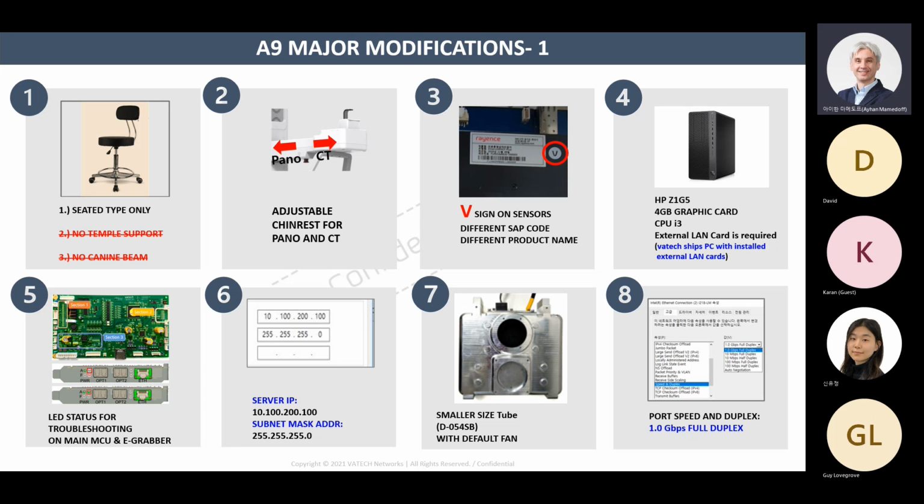The 6th innovation or modification that we did on this one, or change, let's say, is that the IP, the server IP number, has been changed. Why?